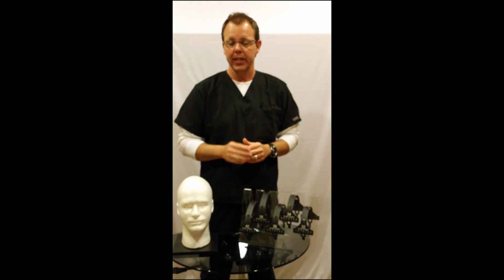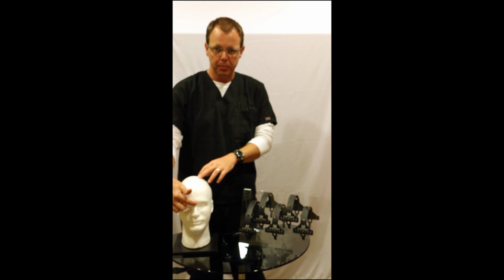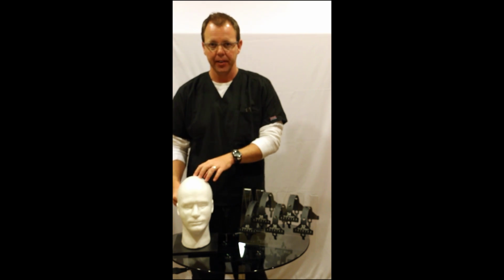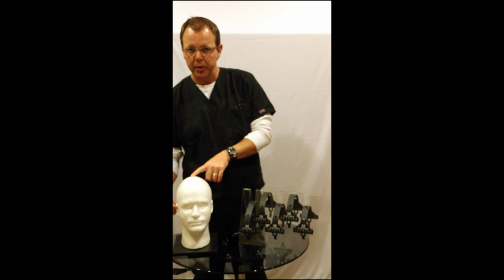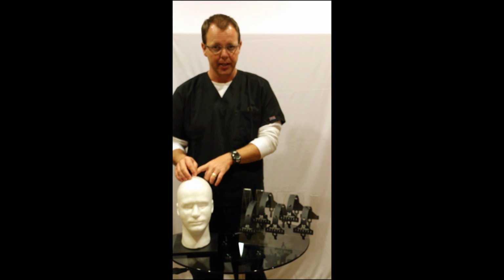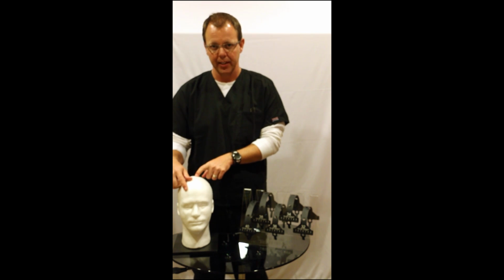Start by taking 3 initial anatomical measurements. You're going to mark from nasion to the inion, and we're going to call that the Z line. Then you're going to measure from preauricular to preauricular. We're going to call that the Y line. And then of course we're going to take the circumference of the head and we'll call that the C line.